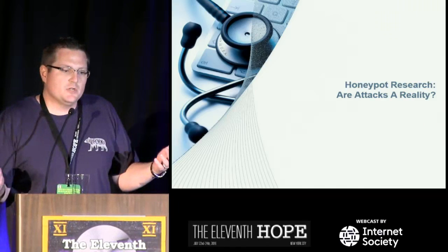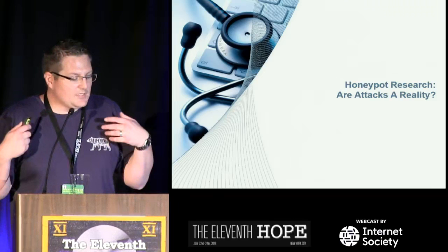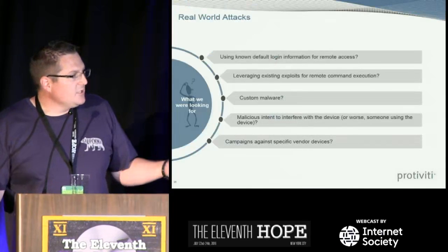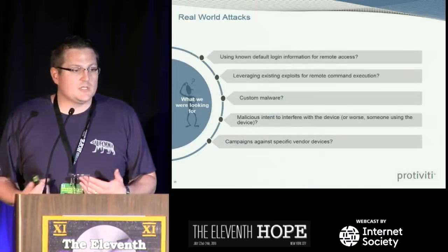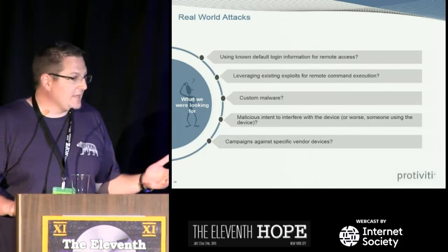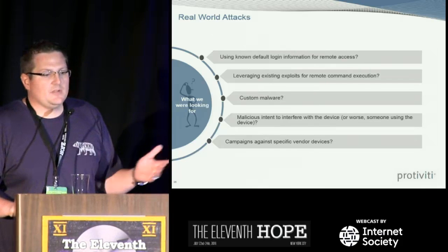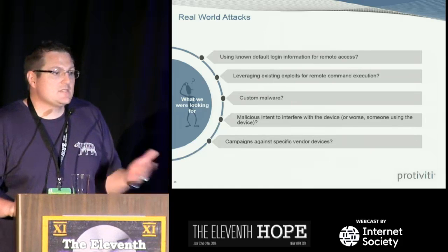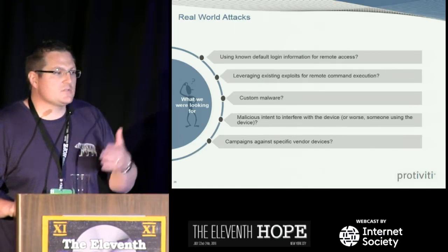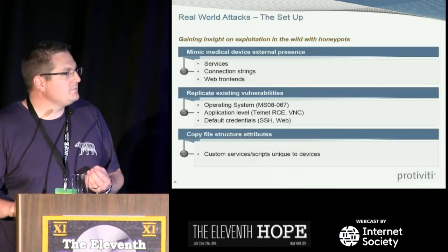So I worked with another researcher, Mark Kalau, who's a massive honeypot guy, to set up some honeypots and see what's happening. We're basically setting them up realistically. If they had poor default login credentials like I showed you, we mimic that completely. We wanted to see: are there specific campaigns against specific vendors? Are they attacking medical devices? If so, is it targeted? Are they trying to steal intellectual property, source code, things like that? We tried to get an understanding of the motivations.